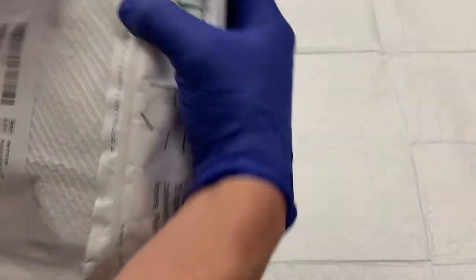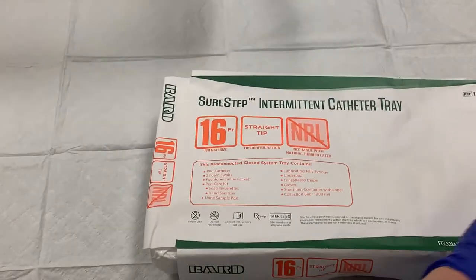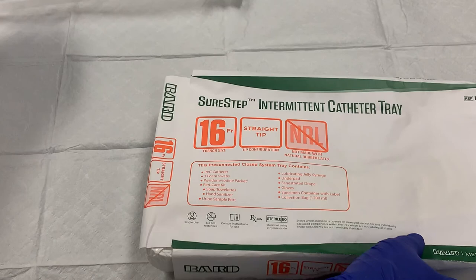Like all BARD kits, to easily open it, put your finger under the green arrow and pull up. The cover sheet shows the size of the catheter. 16 and 18 French catheters are provided in the pod rooms with this kit. Other sizes are available if ordered from distribution, but will not come included with a SureStep kit.